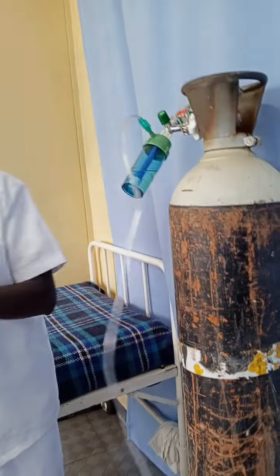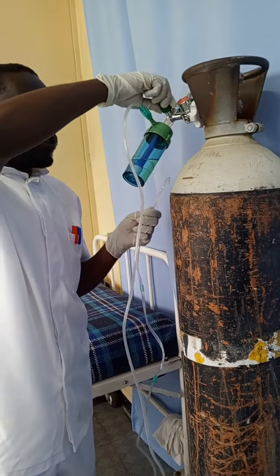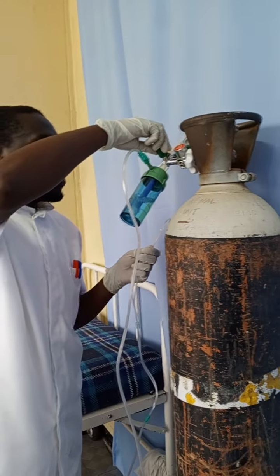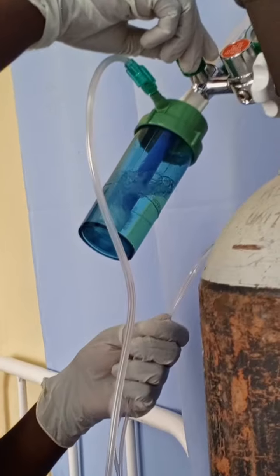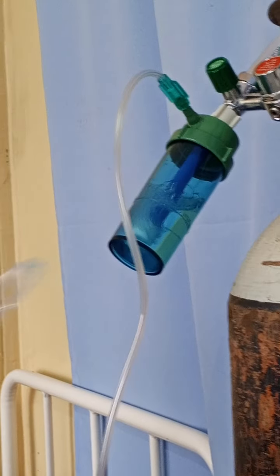Before I connect this to the patient, I need to switch on the adjusting knob. The doctor has ordered that we administer oxygen at 4 liters.